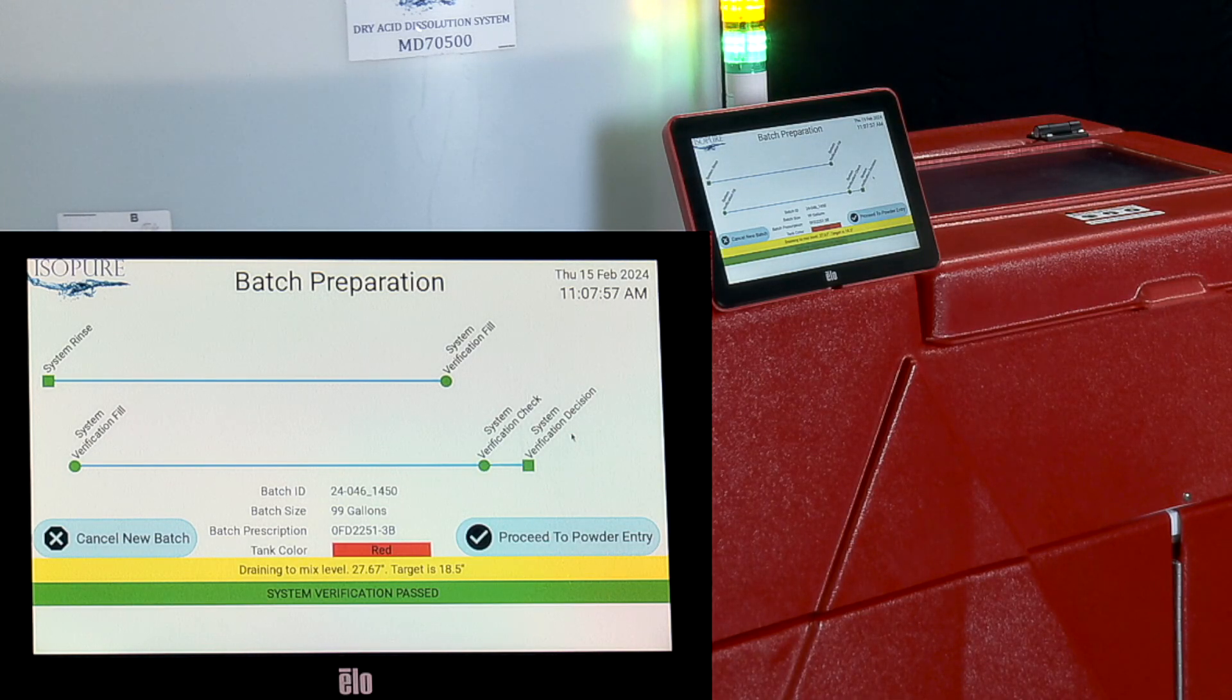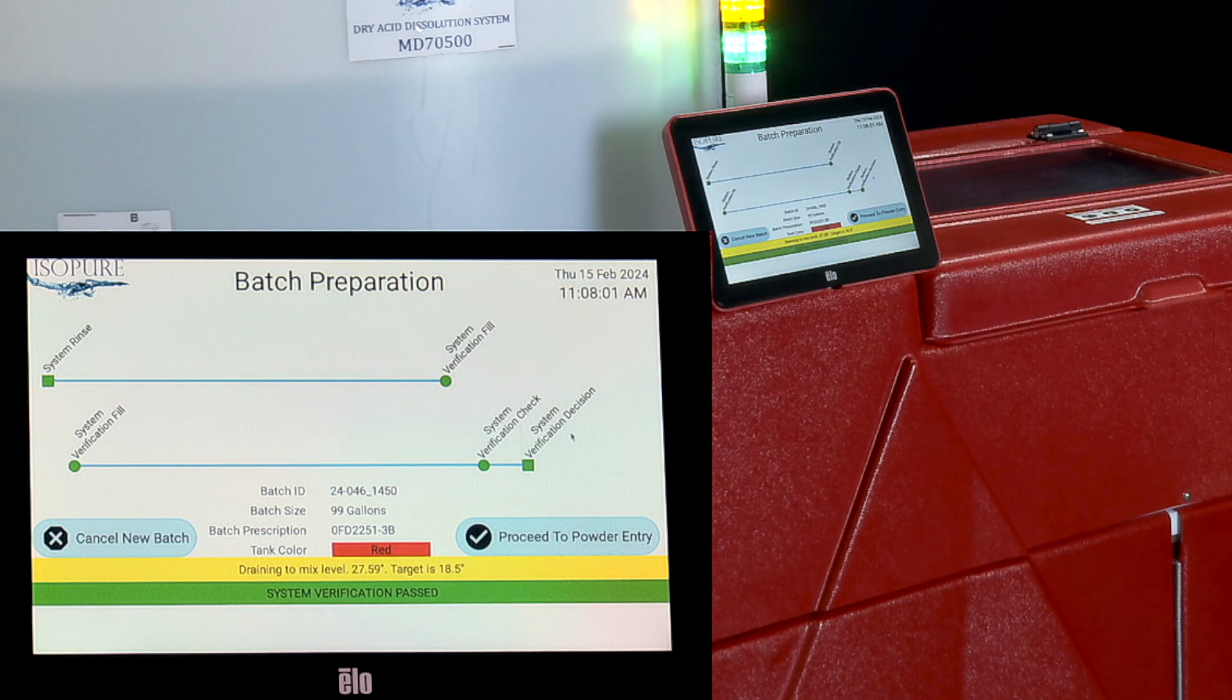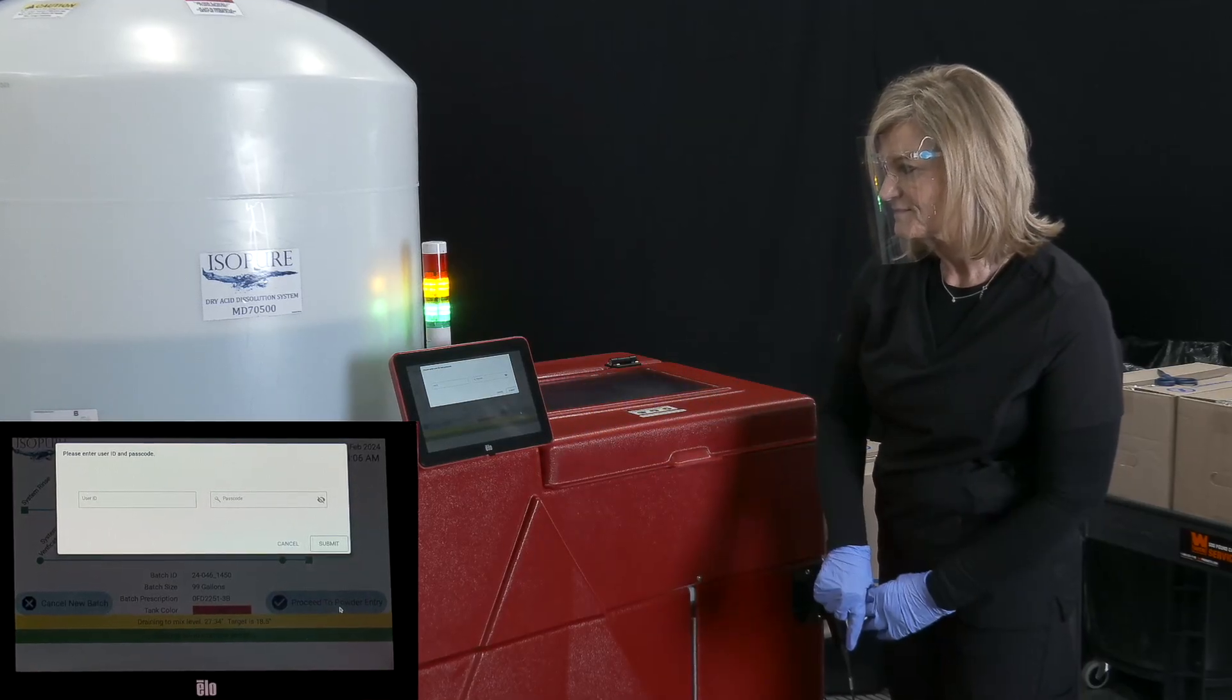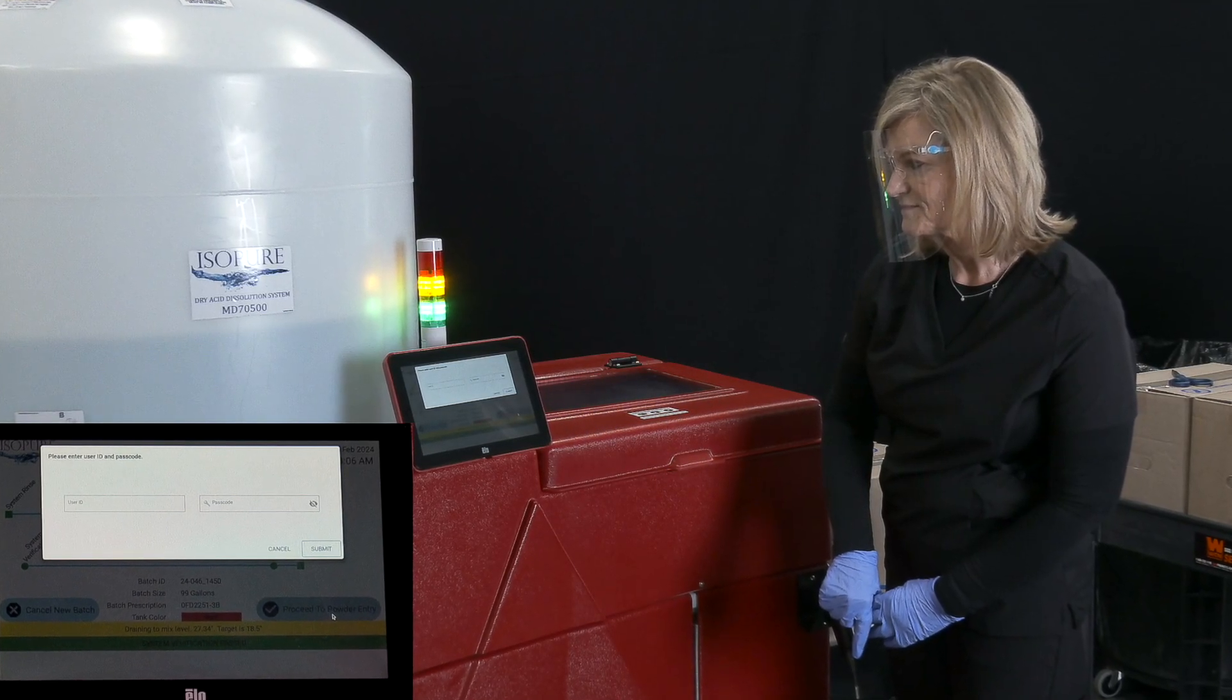After the system has passed all verifications, the green banner and Proceed to Powder Entry button will appear, allowing the operator to begin adding the dry acid granules.